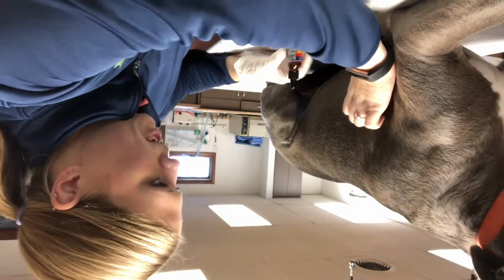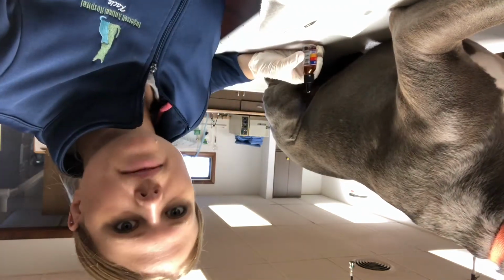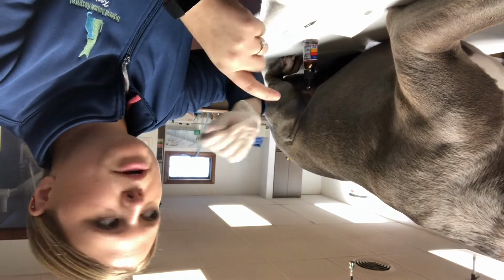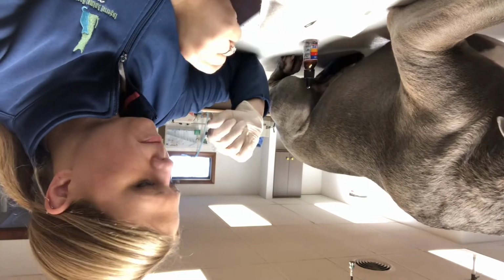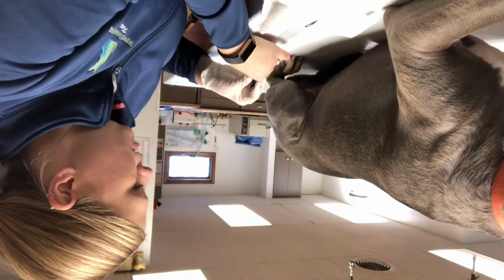I'm going to do a mild, just a superficial skin scrape on the side of the thorax right here. For a deep skin scrape, you will want to shave the area to get better cells, and you do want to continuously scrape the area until you get some of the capillary ooze. But just for the superficial, I'm just going to use my scalpel blade and do one swipe across the area where I believe that there are the external parasites, and then put that directly on my microscope slide. For this, you do use mineral oil.